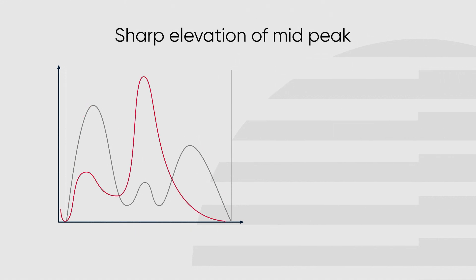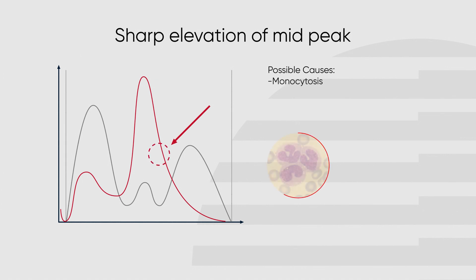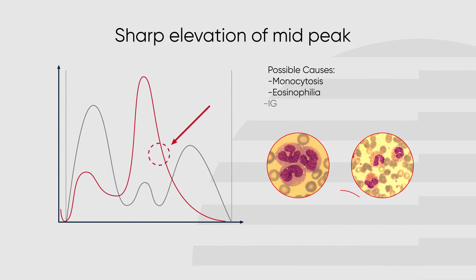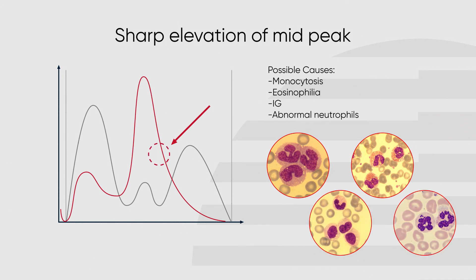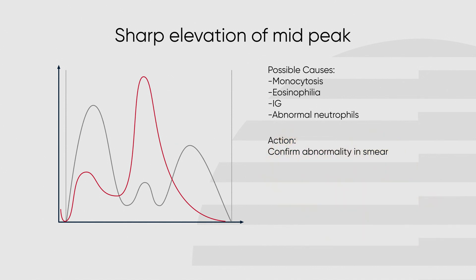A sharp elevation of the mid-peak could have several possible causes, such as monocytosis, eosinophilia, immature granulocytes, or abnormal neutrophils. The high increase of mid cells or abnormal cells causes the peaks of the mid cell and granulocyte populations to merge, and the analyzer is unable to distinguish between them. If this occurs, proceed to confirm the abnormality in smear.